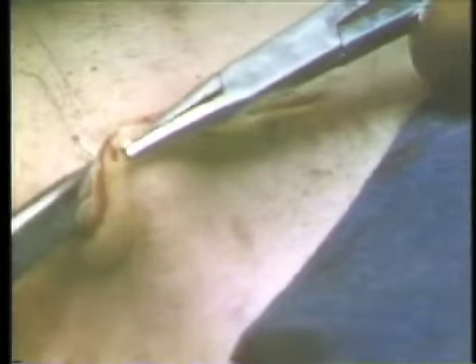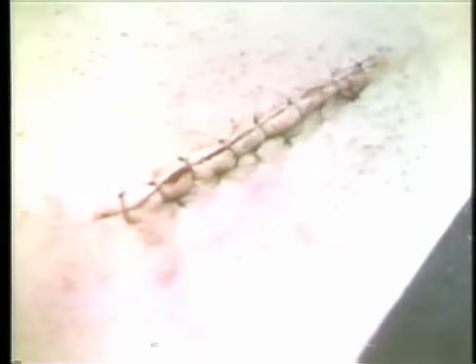This is a vertical mattress suture designed to give some slight eversion to the skin margin, anticipating the characteristic depression of scars, and by doing this, the final result will be a flat scar when healing is complete. So we now have the wound closed, and the pressure dressing will be applied.